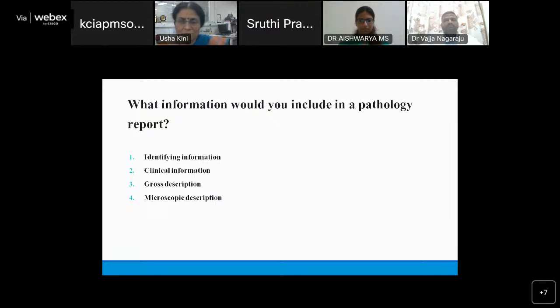It's the same way. You describe it very precisely, not too long, maybe some 2-3 points, positive as well as negative points. Both are essential. To start with the positive, what is there in the slide? What are the findings? Maybe they are important, yes, diagnostic characteristics. You describe those. And maybe you were looking for something and you didn't find it, and that is relevant. That needs to be mentioned. This is very important because if someone reads your microscopy, they must be able to visualize what you looked at under the microscope.